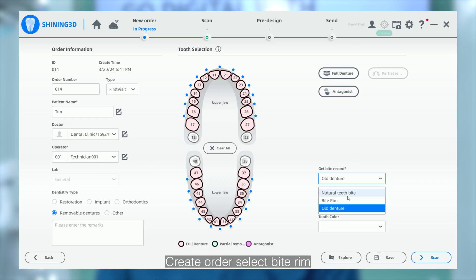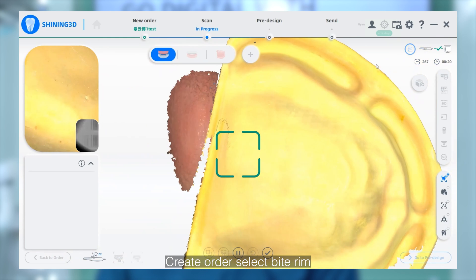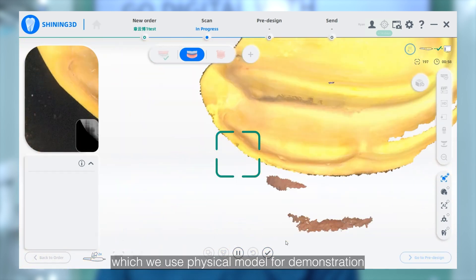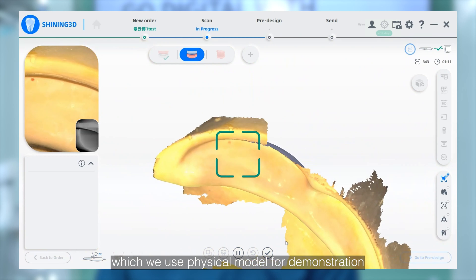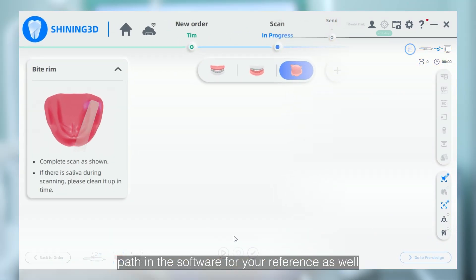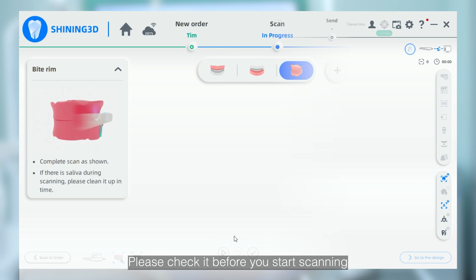Let's focus on the bite rim scan workflow. Create an order and select bite rim. After scanning the edentulous upper and lower jaw — which we use a physical model for demonstration — the third step is to scan the bite rim. We provide the scanning paths in the software for your reference as well. Please check it before you start scanning.